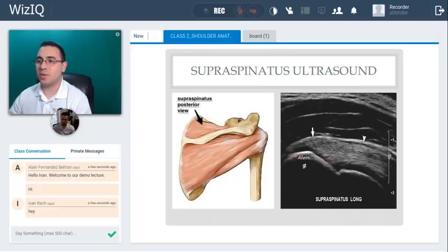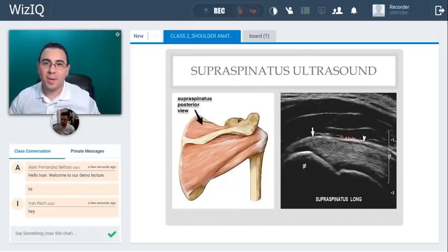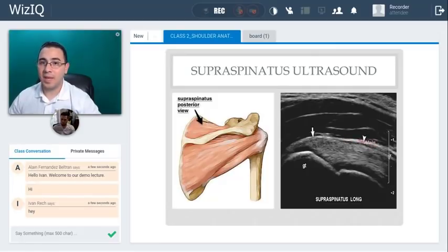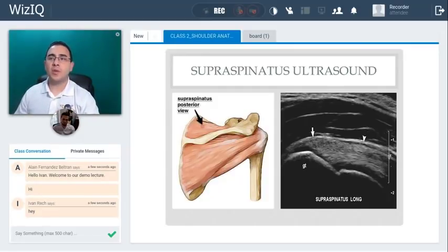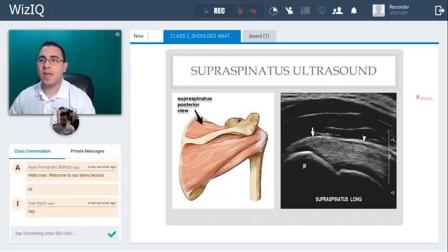This is the supraspinatus with the greater tuberosity — that's where the supraspinatus inserts. There's a small, thin hypoechoic structure on top, which is the subdeltoid subacromial bursa — a pretty common place for injection for pain. That's the posterior view, because remember the supraspinatus is seen from the posterior approach. There are different patient positions used to get these pictures, which we will study later.